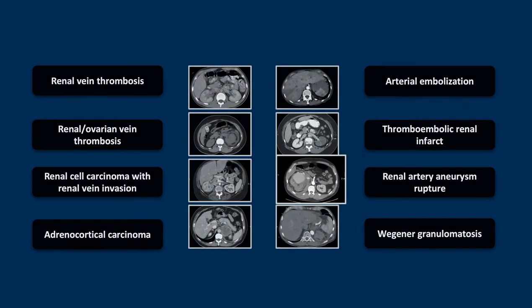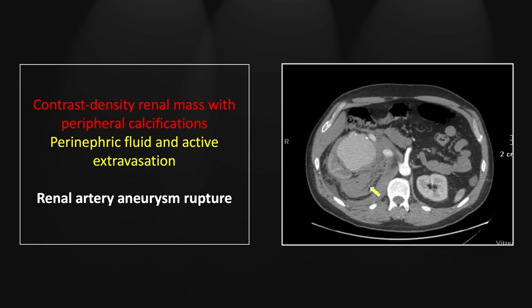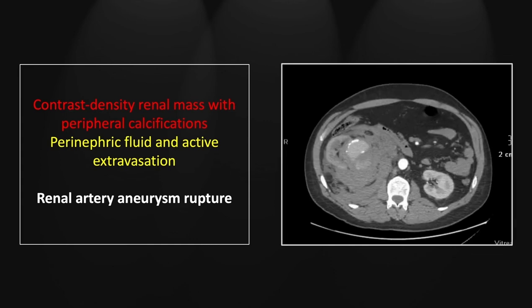Our next case is a renal artery aneurysm rupture. You can see here continuity between the right renal artery, which is markedly expanded and tortuous, and this homogeneous enhancing mass with peripheral calcifications denoting a vascular structure. Note also there is extensive perinephric fluid, which is slightly hyperdense, suggestive of hemorrhage. More inferiorly, you can again see that homogeneous enhancing mass with peripheral calcifications, and there is also an ill-defined collection of contrast density consistent with extravasation.